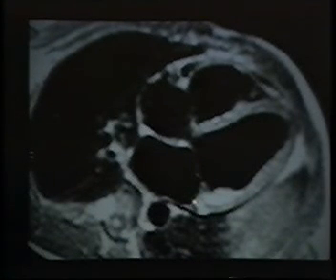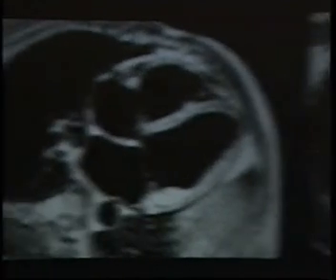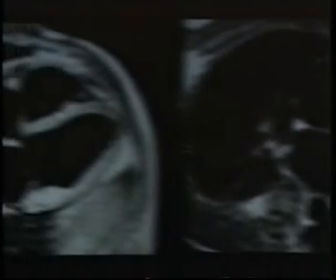These are not neoplasm. They look like a mass. They are fibrous plaques, and sometimes they have a mural thrombus sitting on them. This is first and second echo images of such a patient. The patients usually die of their heart disease within 6 to 8 months, 6 to 12 months at the time the original diagnosis is made. But this is not a tumor.